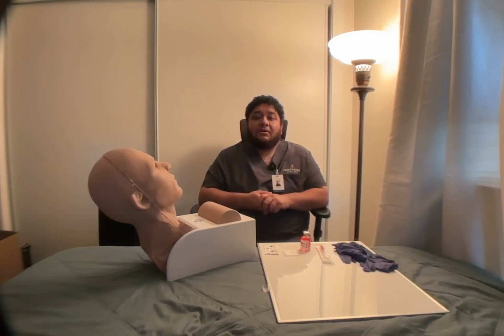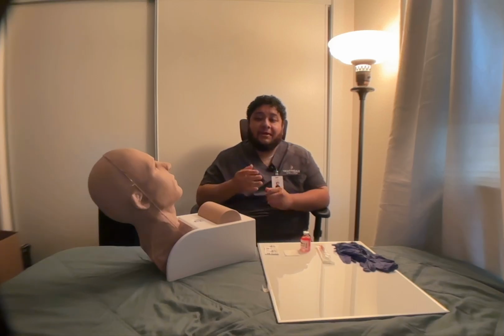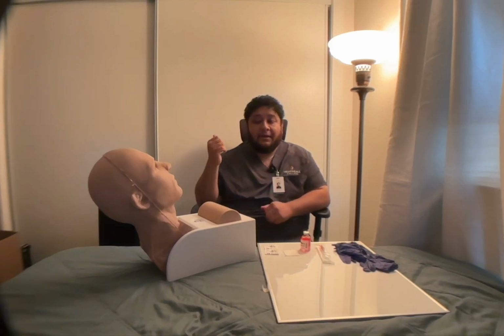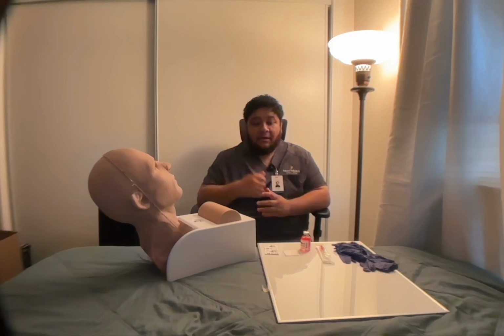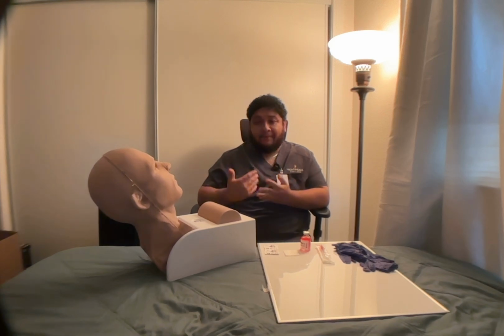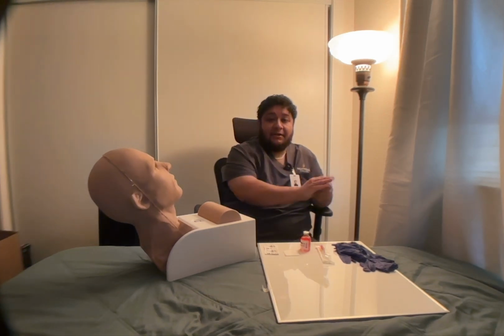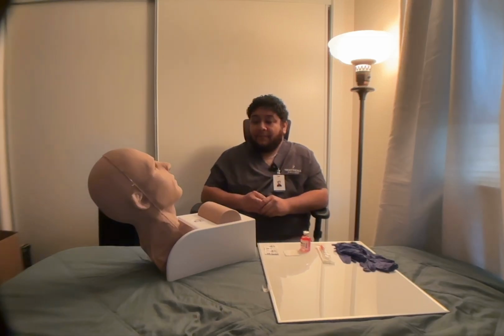Okay? Once I'm done with that, I will go ahead and gather my supplies and enter my patient's room. I will close the door behind me to ensure patient privacy. Once I'm in there, I'm going to set my supplies on a clean flat surface. First I'm going to perform hand hygiene, and then introduce myself to my patient.